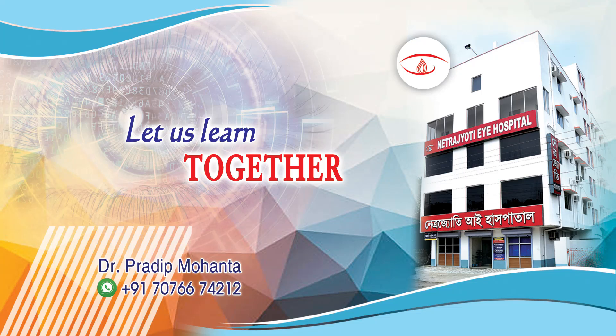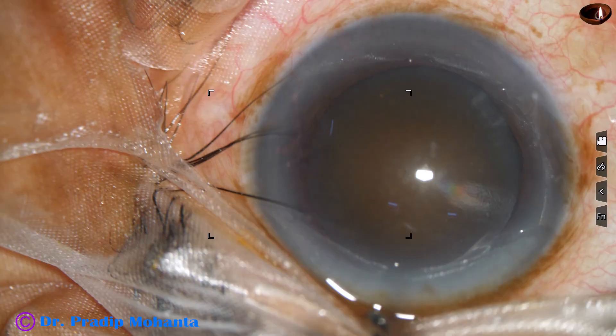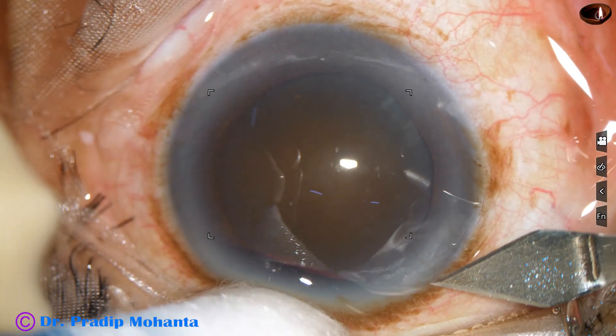Friends, welcome to my workplace at Ranaghat, West Bengal, India. A 90-year-old gentleman has come with this rock-hard cataract. Let us observe this surgery.